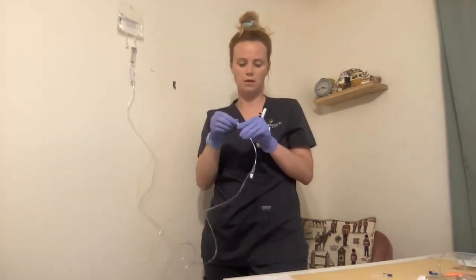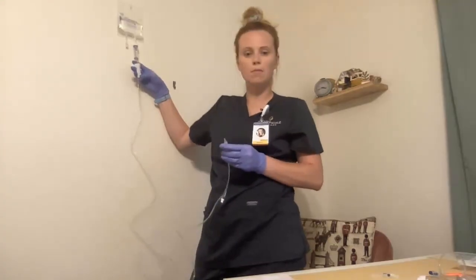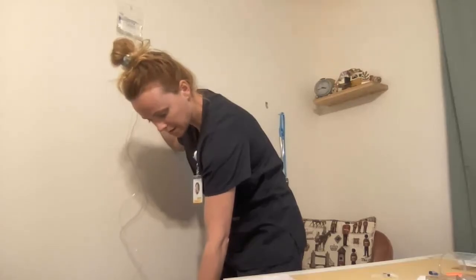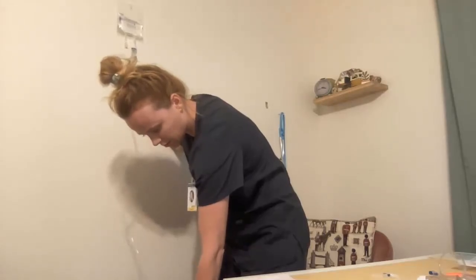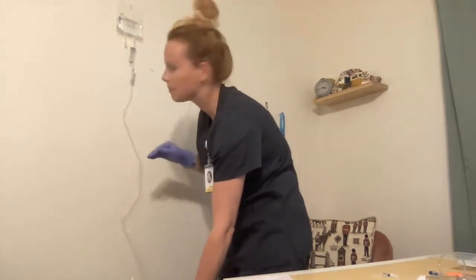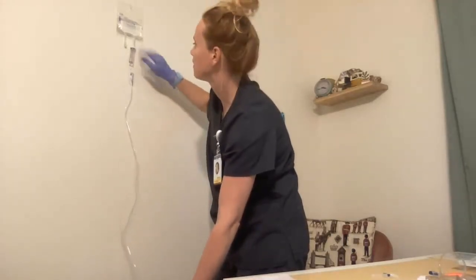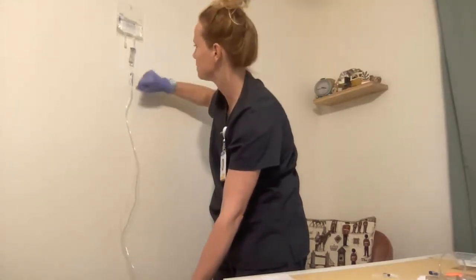Now I'm going to remove the end cap and prime the tubing. When priming, I don't want to open the clamp all the way — that can cause more air to enter the tubing — so I'm going to slowly unroll the clamp and let the fluid drip out into my trash can. I want at least a couple drops to come out. Now that I've primed the tubing and removed the air, I'm going to count 38 drops per minute for the fluid. I'll count for one whole minute. If it's too fast, I regulate it; if too slow, same thing — I regulate it.